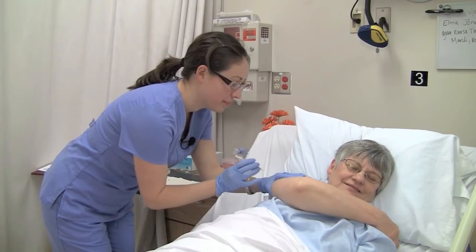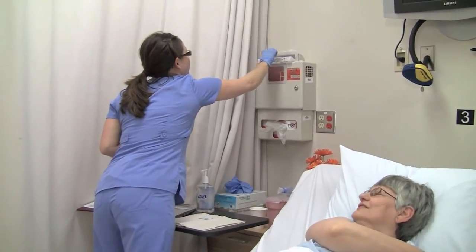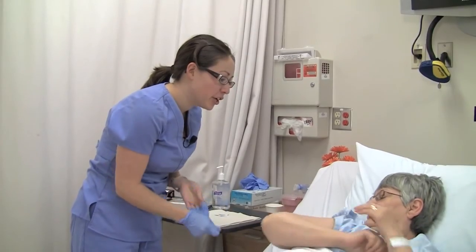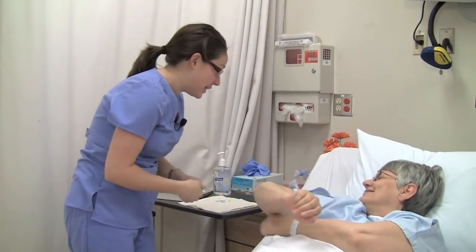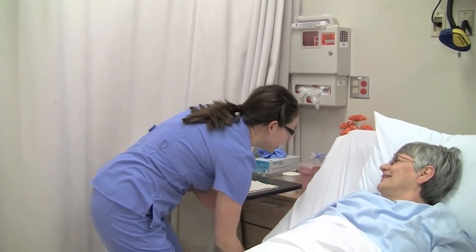The needle's coming out now. Discard the needle and syringe into the sharps container. As always, document that you gave the medication on the MAR, including the injection site. I'm going to let you get some rest, and I'll come back and check on you in a little while. Call me if you need anything at all.